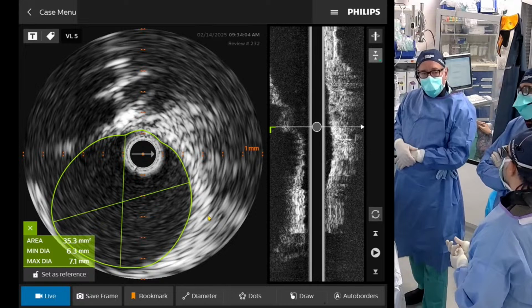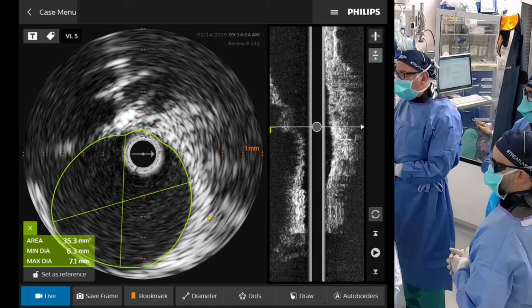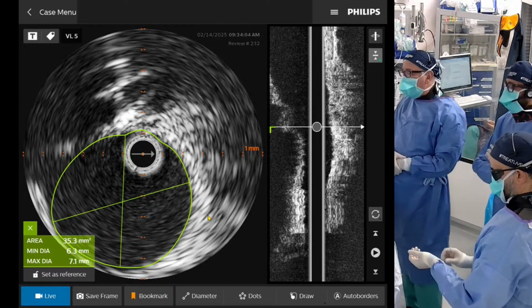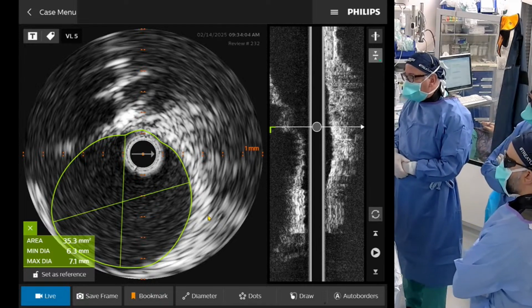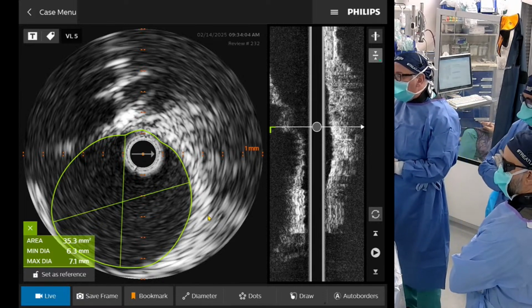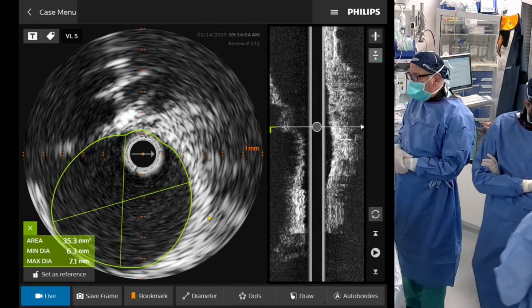So Rob, just out of curiosity, the Megatron is 5. How far would you feel comfortable over-dilating if you really wanted to put a drug-eluting stent? We've spoken about how far you can take these 5 mm coronary stents before the polymer starts to fragment, and that's the overall concern. If you don't get uniform, reproducible drug delivery, and you can't map out the pharmacokinetics of the anti-inflammatory or anti-proliferative agent, you're really just rigging a drug-eluting stent to behave like a bare metal stent. That's not going to help anybody.